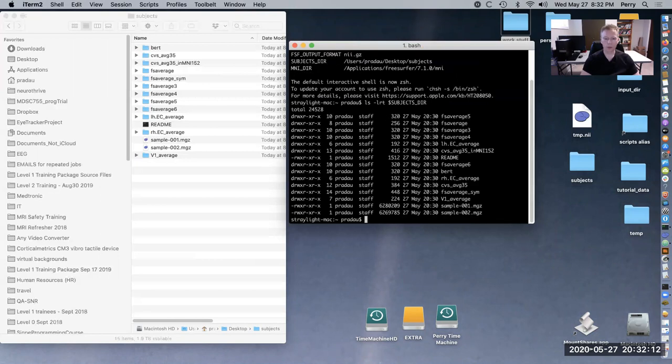Yes, so that works. All right, so that's the end of this tutorial. I hope you found it helpful. I think that covers most of the little problems you'll find along the way of getting started, and so it'll make your journey into Freesurfer usage a bit easier and set you off on a good start.